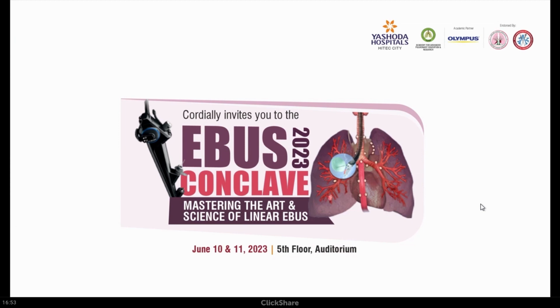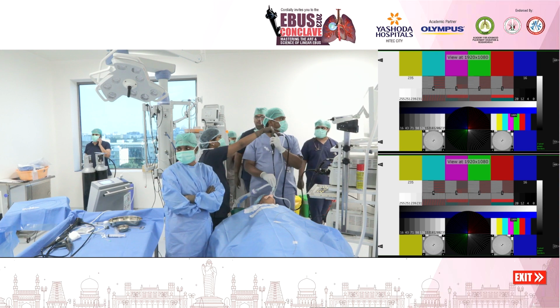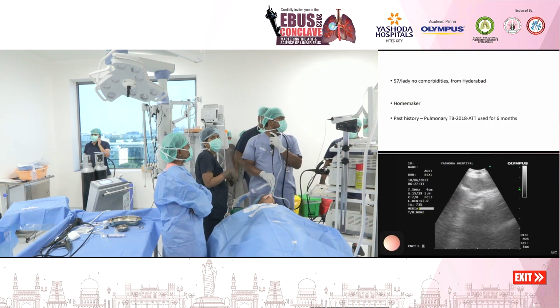The imaging has not shown very big lymph nodes, but it is a central mass, a hilar mass. So I think we will switch over to the OT transmission and see how they will do, whether they'll find a node or not. This was actually PET negative, in the sense there are no other mediastinal nodes which are positive other than the mass.